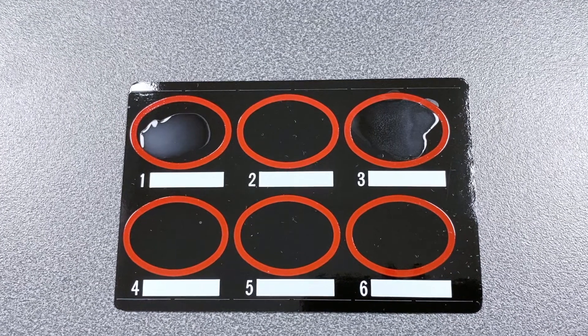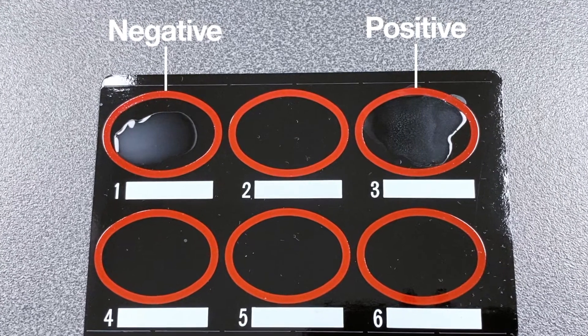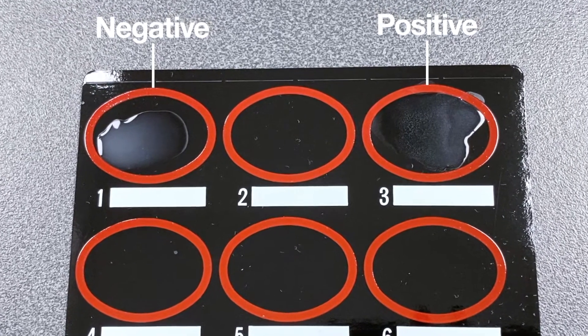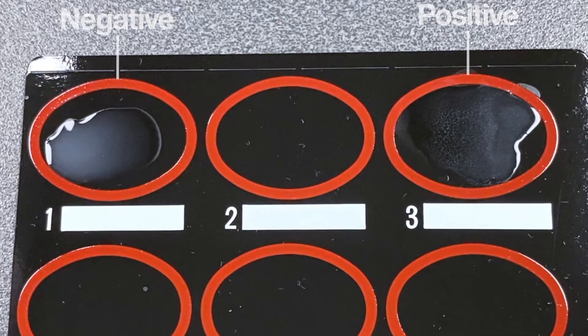Finally, compare your sample with the positive and negative control areas. For a normal sample, no agglutination will occur and the mixture will retain its smooth appearance. Further testing can be ruled out.